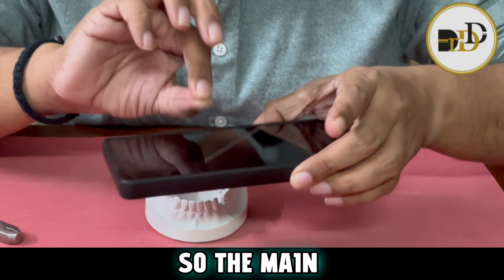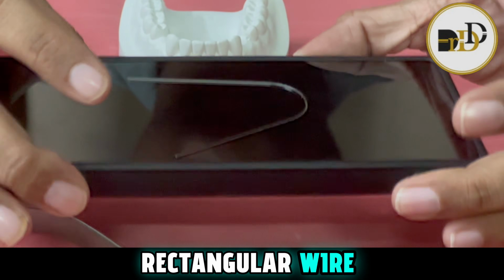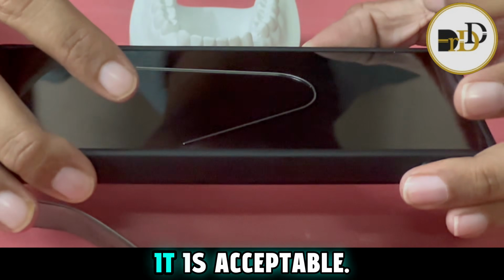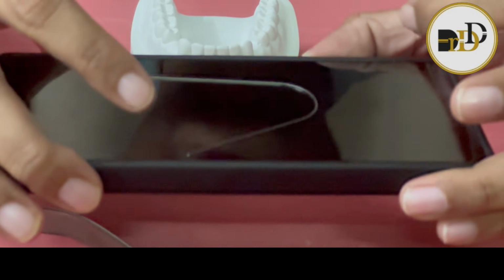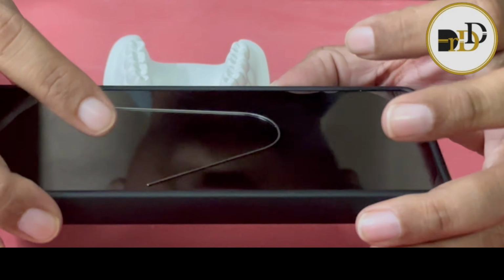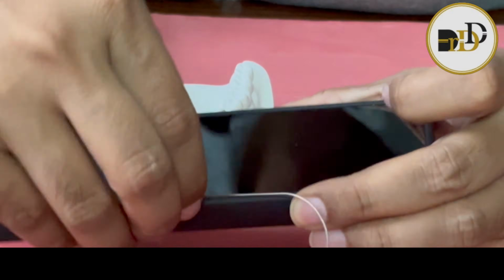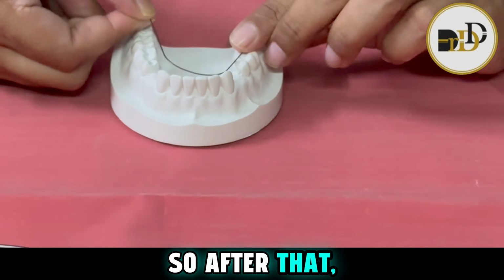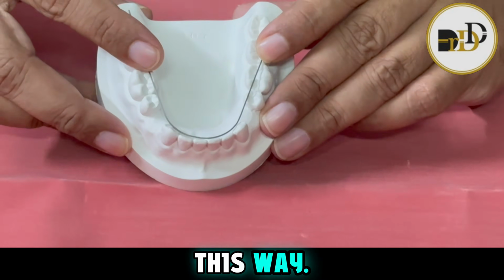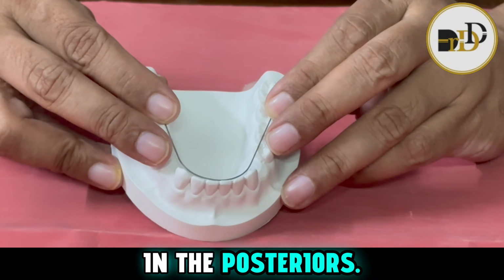The main important thing we need to check in the rectangular wire is the plane. In the round wire, some amount of deflection is acceptable. But in the rectangular wire, it needs to be perfectly in the plane so that we don't get any unwanted torque or plane variations when we engage it in the patient. After that, it needs to pass in this way through the fossa in the posteriors.